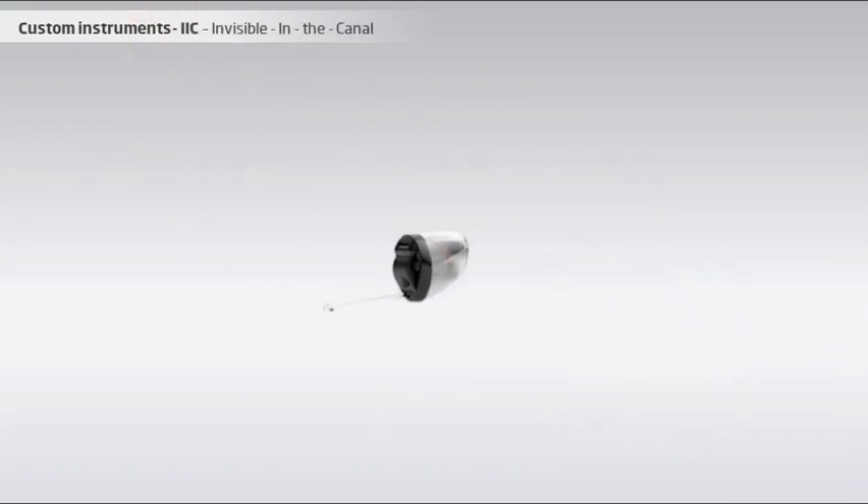The IIC sits deep in the ear canal and is practically invisible from the outside. The outside facing surface is usually black in order to blend in with the dark color of the ear canal opening. Cosmetically, the IIC is the most attractive custom instrument. However, since it sits so deep in the ear, it cannot have buttons for changing the programs or volume, and it is the custom instrument with the fewest features. Despite the small size, the IIC requires a relatively large ear canal to have space for all the components. About one-third of hearing instrument users will have an ear canal which is big enough to fit an IIC.